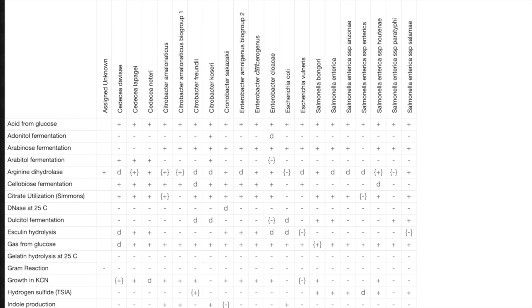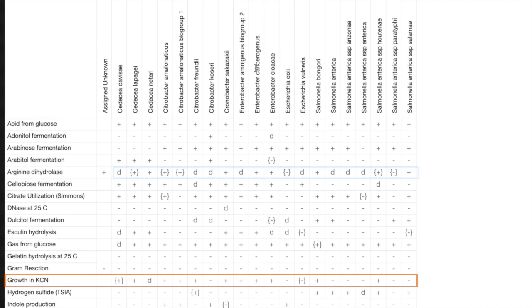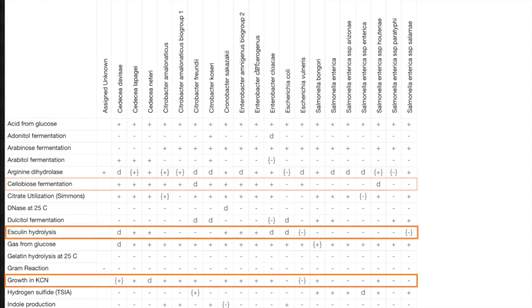Likewise, it makes no sense to choose a test with lots of plus signs in parentheses, D, and minus signs in parentheses results because these do not contribute to eliminating microbes. You should choose a test where the remaining microbes have a good mix of positive and negative, so some will be eliminated no matter the result obtained.